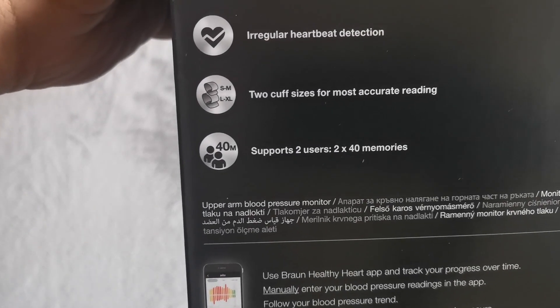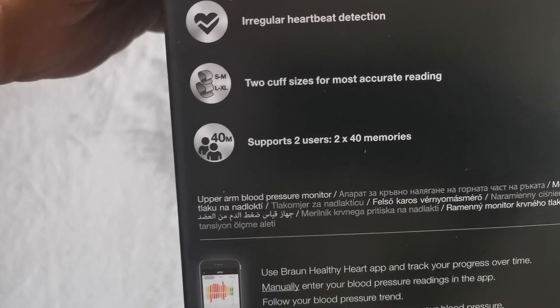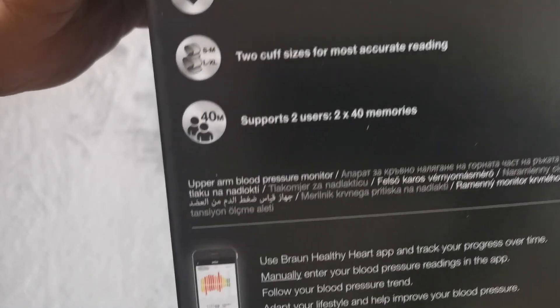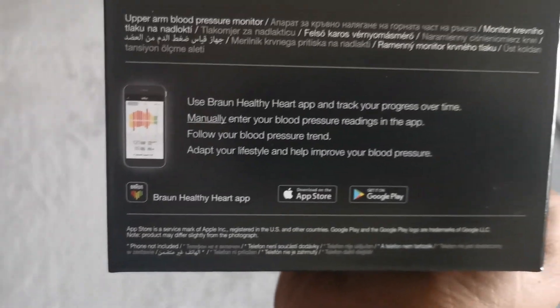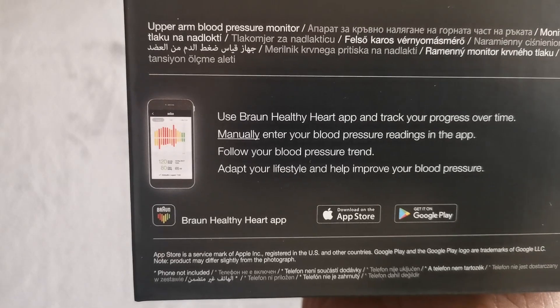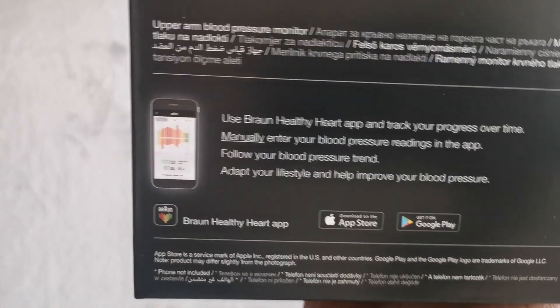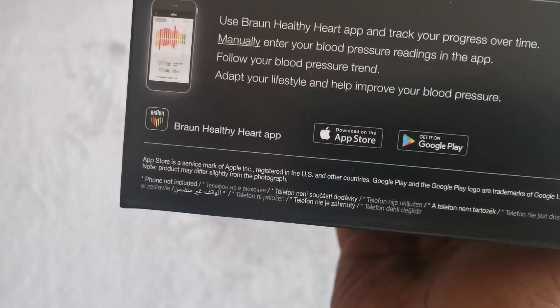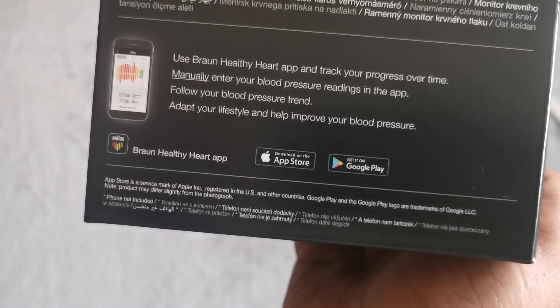Two cuff sizes for the most accurate reading. Supports two users. Around 2x40 memories, which is good. Plus you can download an app and use it to track your blood pressure — everything recorded. I haven't downloaded it yet so I don't know all the functions.